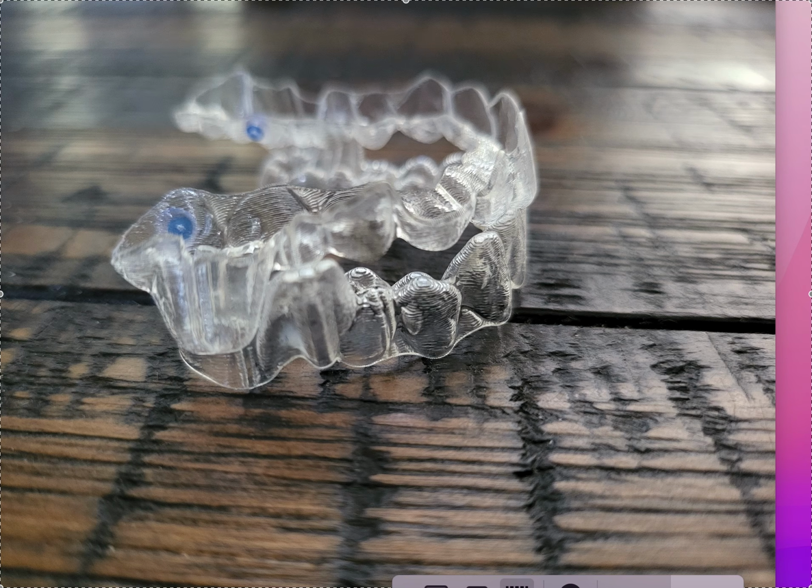StraightSmile Solutions, StraightSmileSolutions.com, and today we're going to talk a little bit more about Invisalign with MA. MA stands for Mandibular Advancement, and it's something that we've been using in not this exact product, but a derivation of this product in orthodontics for, I don't know, a century, like a really long time at least. So it's nothing new for orthodontists. It's kind of new in that it's married to an aligner.